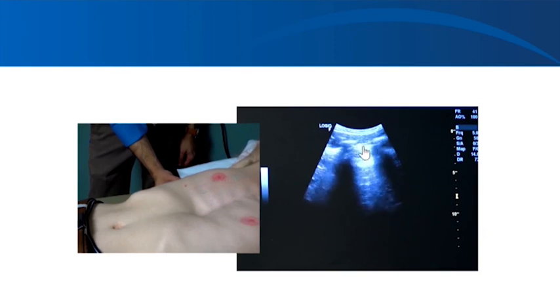You see this right here? The pleural line with the ribs together appears like a bat. Sometimes that's called a bat sign. It's important to know this because sometimes you'll have hyperechoic lines above the ribs, especially in patients who are obese, who have a lot of subcutaneous tissue, and you shouldn't confuse that hyperechoic line with the pleural line, which is usually slightly inferior and in between 2 ribs.